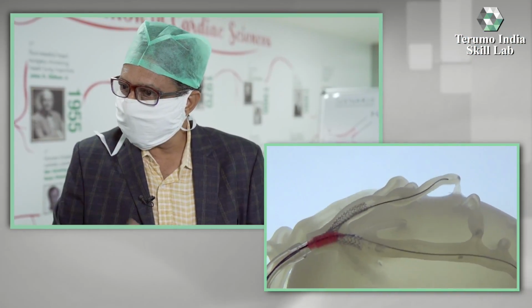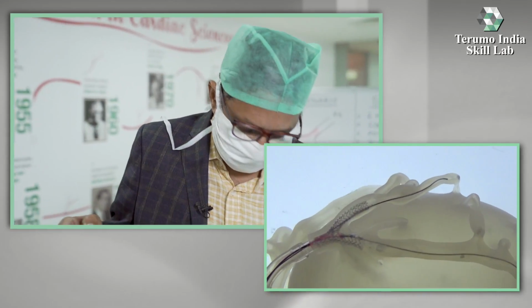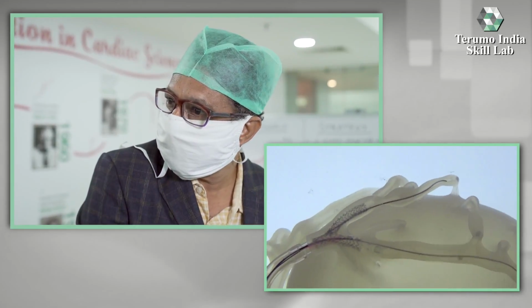So your carina is clean and the cells move away, and now wiring the side branch will be easier. Okay, you recorded this? This is the most important, this is a very key thing.